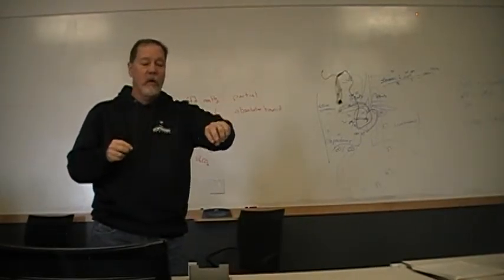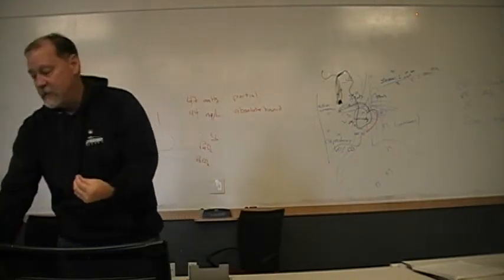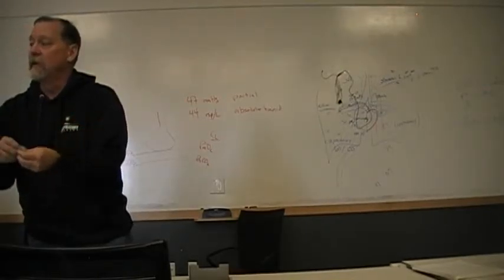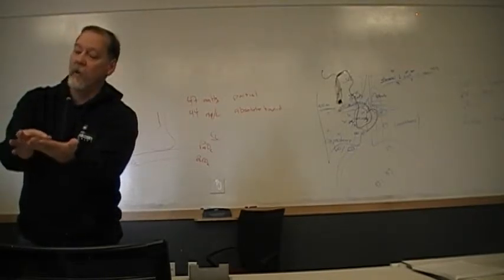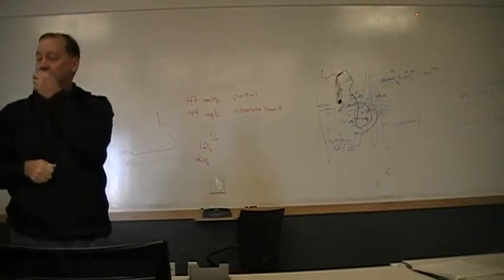And that's why when I take off the cap on one of those to draw a blood gas, I'll put it inside of like the syringe container. I'll put it right side up and set it down with purpose on top, so that when I take that back off and stick it back in, it hasn't touched anything.